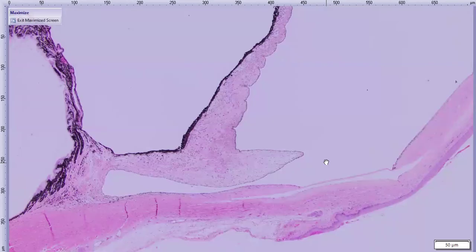And then, if we're thinking about this as a trauma, it's odd that the other eye was presenting with similar complaints. Technically, you can get trauma to the other eye with the same trauma that may have traumatized this one. Is it a male or a female? I believe male. So you wonder about headbutting maybe. That's what I was thinking. Do you see that really commonly with goats? Yeah, I don't see many goat eyes, but you'd think that they'd have enough adaptations essentially to accommodate for the headbutting. It also doesn't mean it doesn't happen. That's true. Okay. But I don't know. Maybe goats.